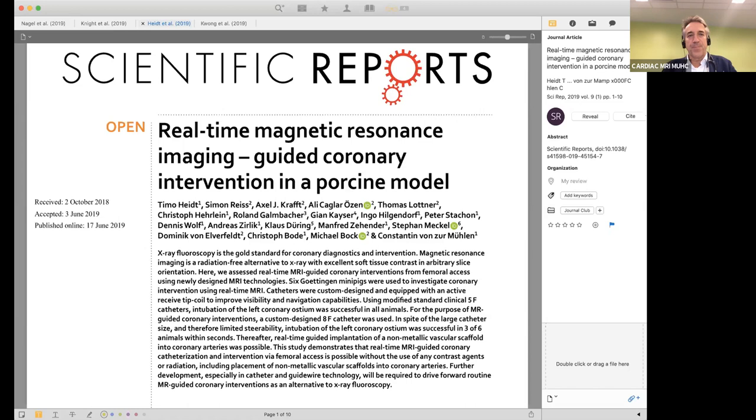Now, interventional CMR has been around for a while, and it was initially a slow start. There were lots of roadblocks, mostly the material that was used, because interventions require catheters and guide wires that need to be controlled and steerable. So the torque and the materials play an important role, and it was difficult to produce suitable material.